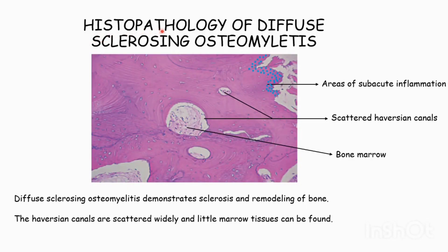Histopathology of diffuse sclerosing osteomyelitis. Diffuse sclerosing osteomyelitis demonstrates both sclerosis and remodeling of bone. The Haversian canals are scattered widely and little marrow tissue can be found in them.